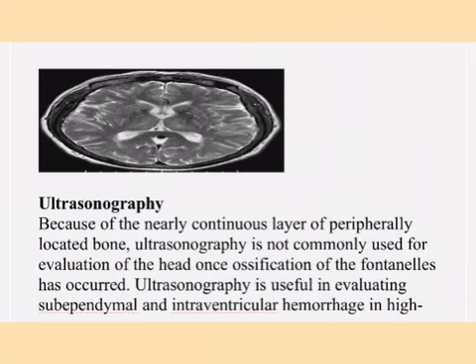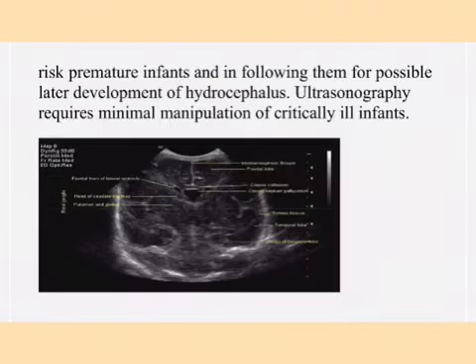Ultrasonography is useful in evaluating subependymal and intraventricular hemorrhage, particularly in high-risk premature infants, and you need to examine them with ultrasonography and really monitor for likely development of hydrocephalus.